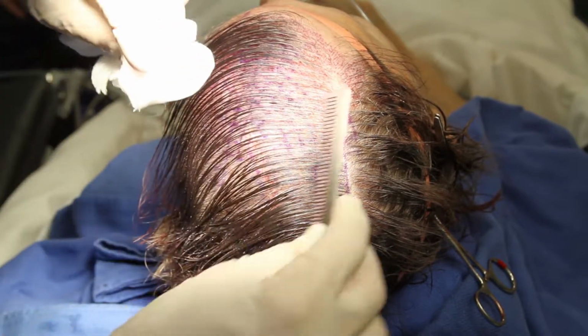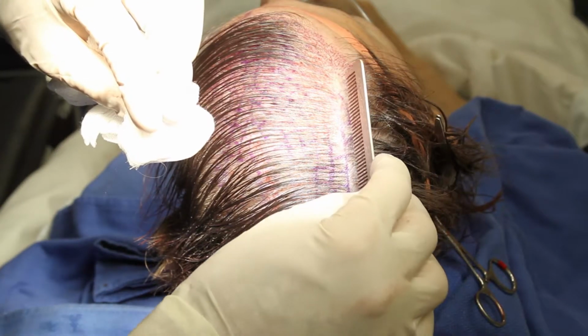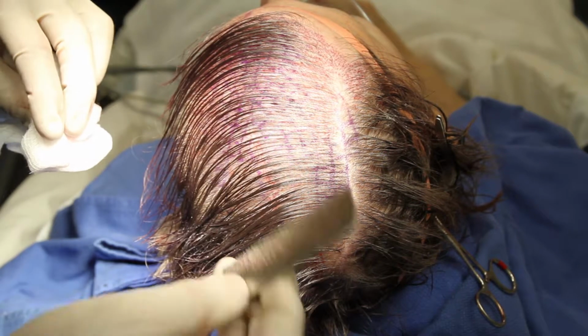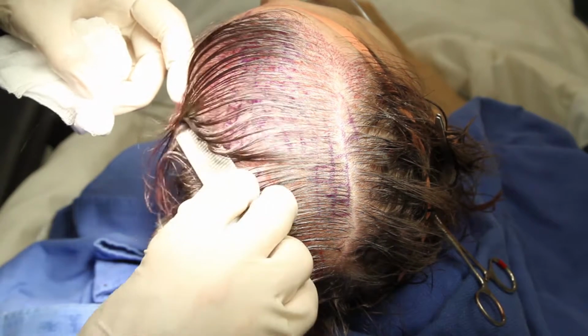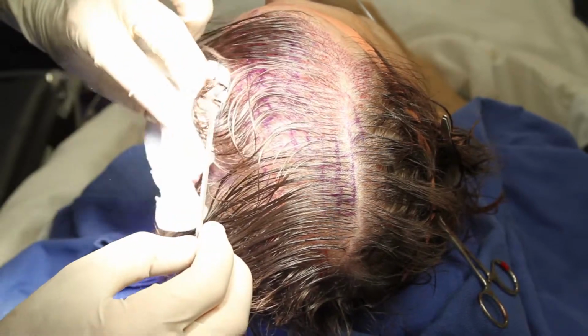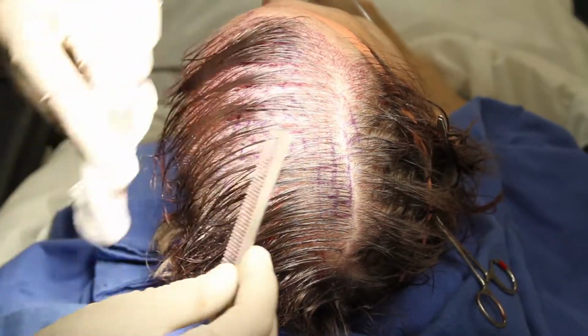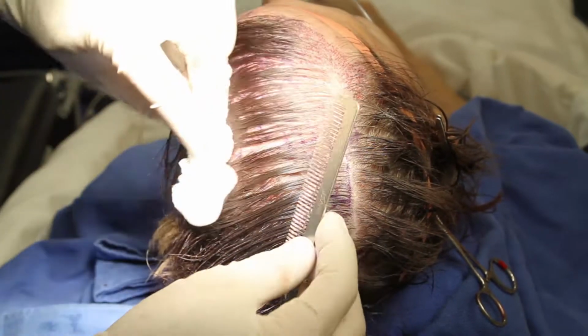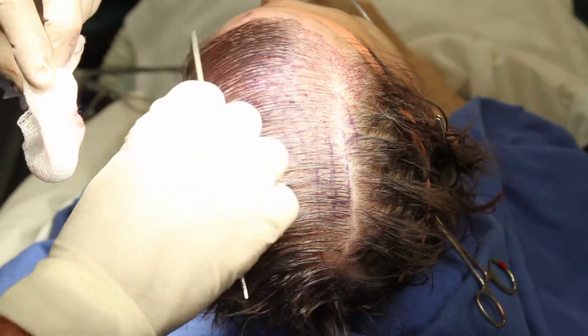So we're well underway with this. He's very comfortable, and we'll be working on increasing the density along this part in the area where he combs over, and as you can see here already with his nascent hair and with the graft sites that we've already created, there will be no bald areas whatsoever. He won't have a comb over hairdo. He'll have a natural hair style.